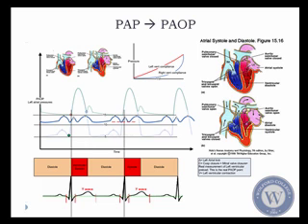If you ever see that the PA pressures are lower than the PA occlusion pressure, it would mean that flow is going backwards, which is not really possible because the heart would then completely stop. But it could be indicating that you have severe valvular dysfunction, and you may have giant A waves, such as in mitral stenosis, or giant V waves, such as in mitral regurgitation. One thing that we'll talk about again when we talk about valvular dysfunction.